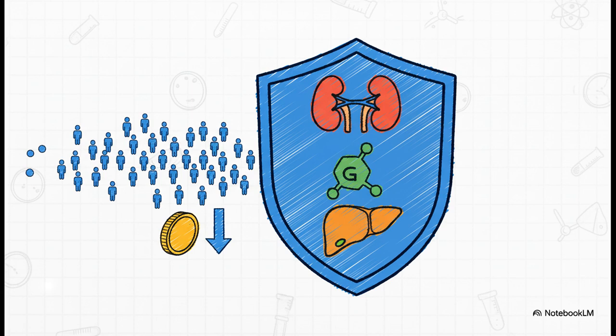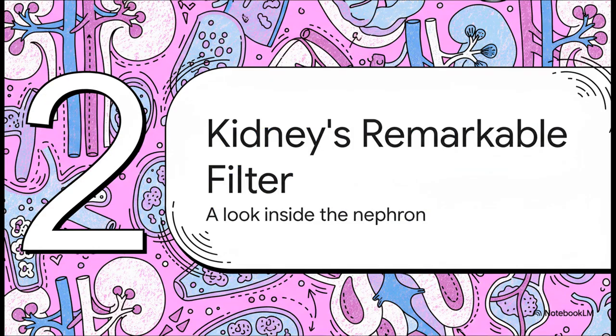And because of this brilliant process, urinalysis is one of the most valuable screening tools we have. You know why? It comes down to two simple things. First, getting a sample is incredibly easy. And second, that sample is just loaded with data. This combo makes it the perfect, low-cost way to screen for major issues like renal disease, diabetes, and liver disease, often long before a person even feels sick.